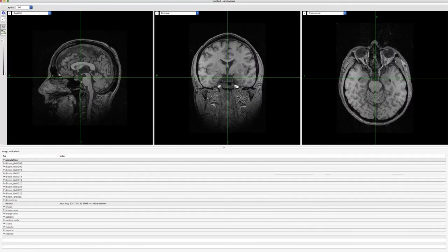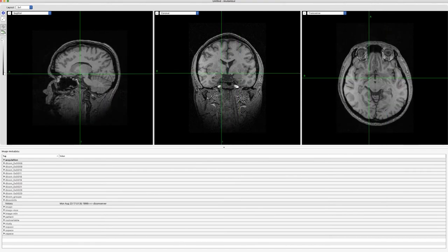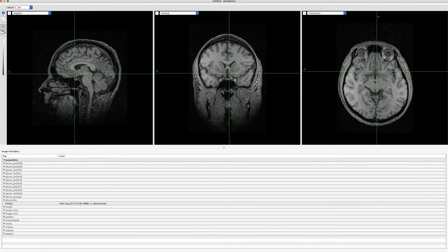So in terms of, we've got quite thick slices running back through the brain and across the brain, which is why we're struggling to get these kind of three images there. We're seeing this one, but again, it's not in the right resolution. So I think the step before, it might need a little bit of tinkering. And unfortunately, because, like I said, my background is not in neuroscience, so I don't know how you would change that resolution there. It's certainly something I'd be able to ask and provide feedback on with some of my colleagues. So, yeah, I'll be able to portray that back to them.